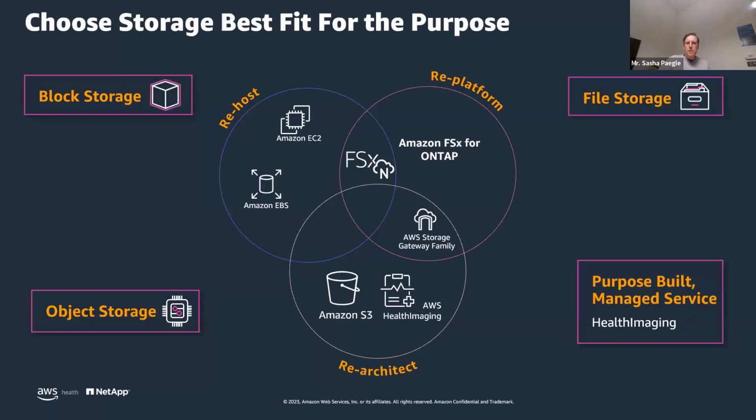And depending upon your comfort level and maturity in using the cloud, your expertise with storage capabilities, and the maturity of the imaging solution you're using, it's very likely that your images are going to flow across multiple storage services that you see here.